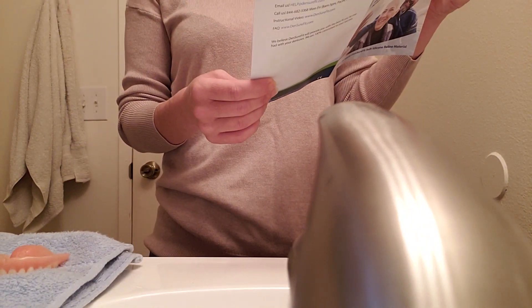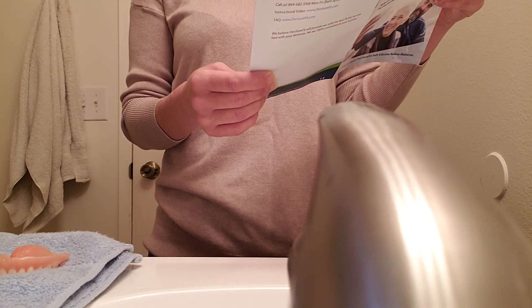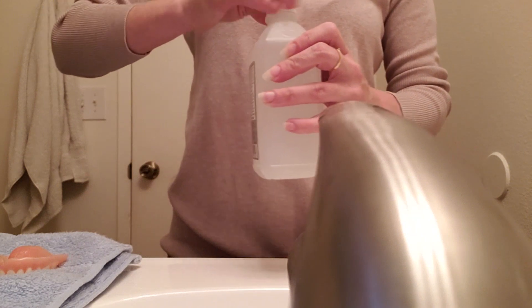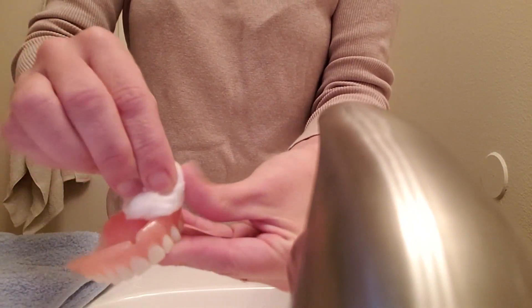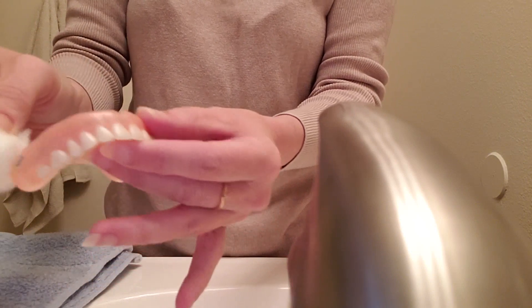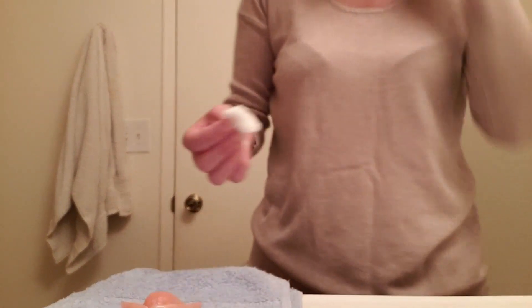Under adhesives, it says to wipe the inside of the dental work with rubbing alcohol on a cotton ball. All right, let's do that. Got a cotton ball and the alcohol, and just rub it on there. I'm going to get the edges too.